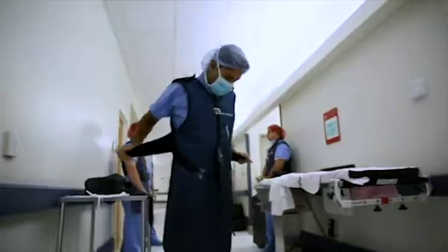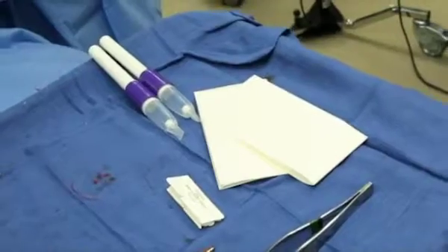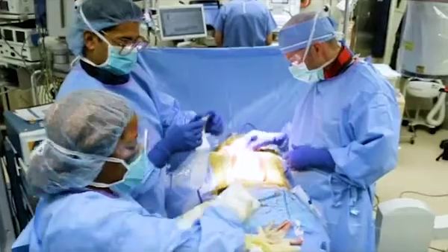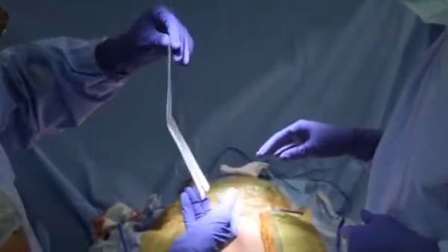As part of the value proposition in healthcare these days and with the triple aim, we've really focused on a whole bundle of various parts of the procedure and products in order to reduce re-operation and return to the hospital. The Dermagon Prineo product is just one facet of that bundle in trying to prevent SSI.